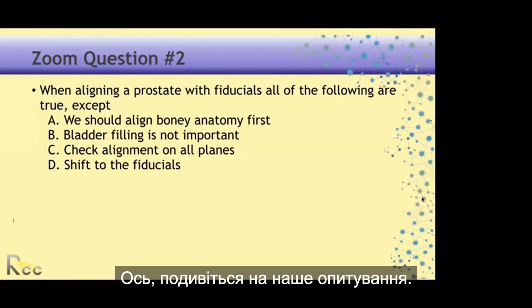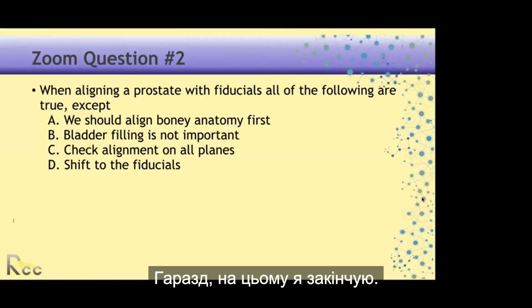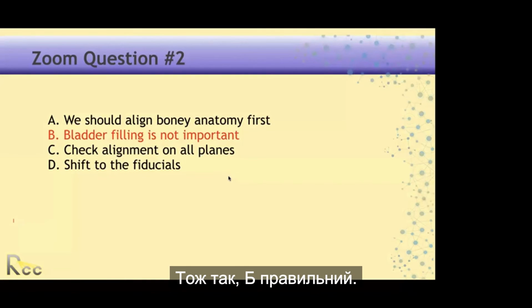Here, and look at our poll. All right, I'm going to end here. Okay, so yeah, looks like B is our number one. Okay, that's perfect. So yeah, B is correct.